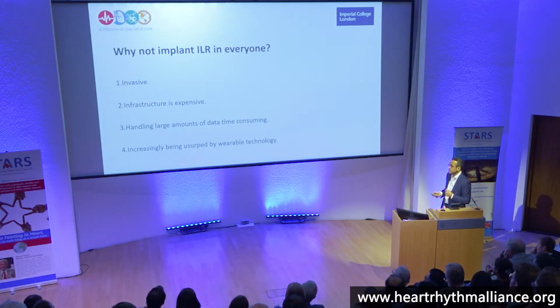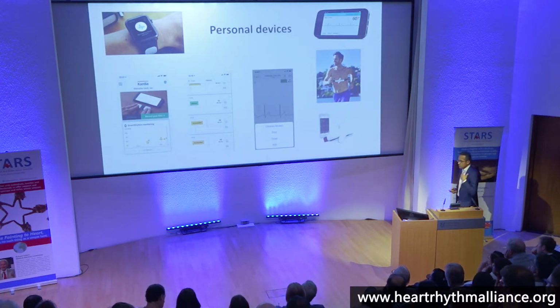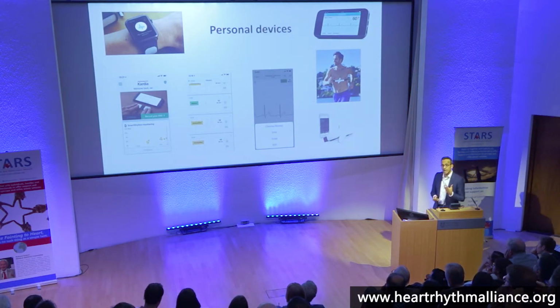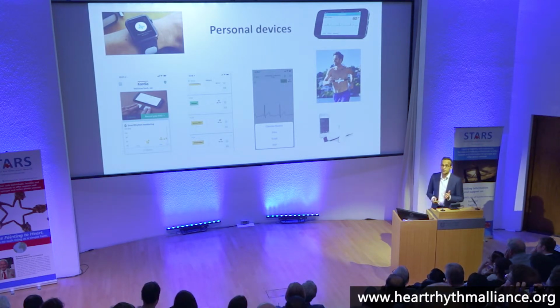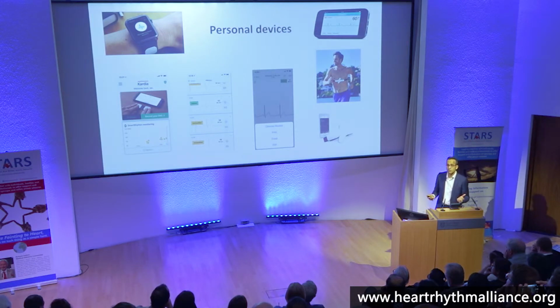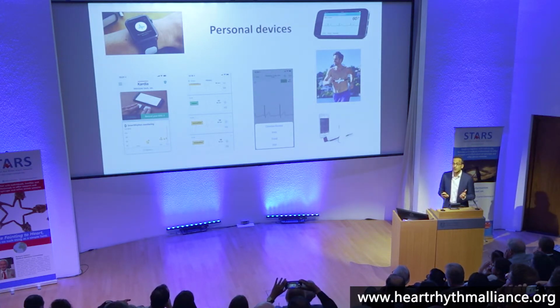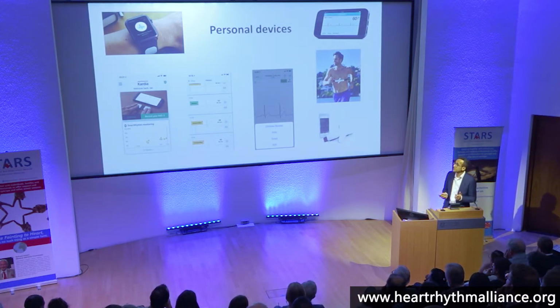And we are increasingly being usurped by wearable technology, which is what I'm going to move on to next, okay? So more and more often now, patients are coming into my clinic with the diagnosis already on their phone, okay? So I'm not even bothering. That's mainly my arrhythmia practice. The technologies are now so consumer-led that patients are easily able to afford these monitors, okay?